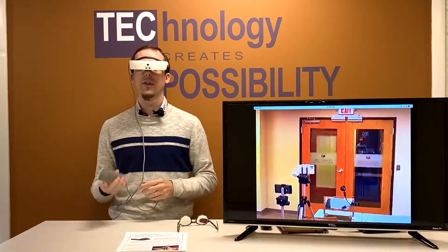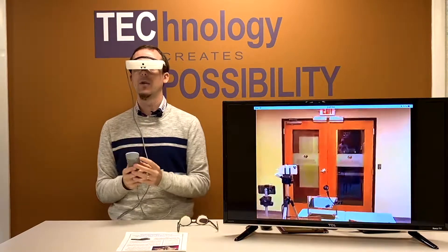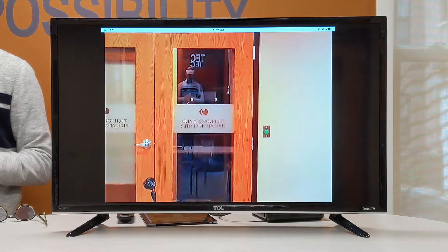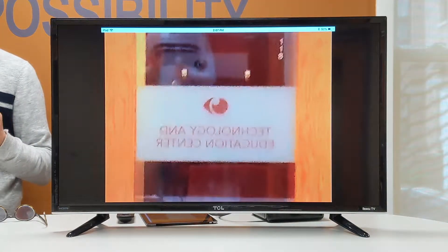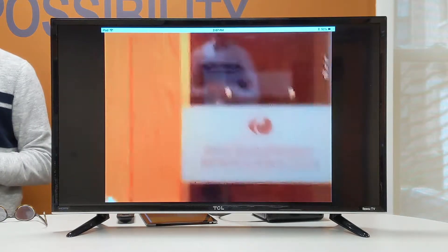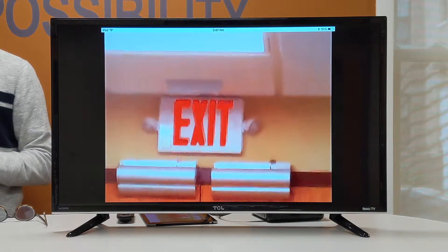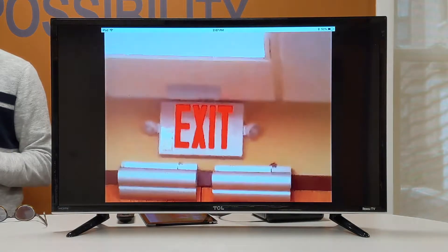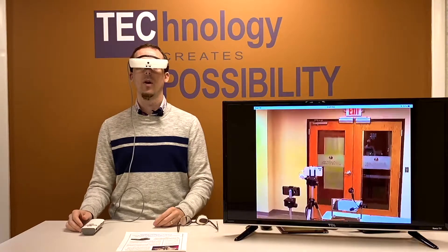Let's take a look at the magnification. This is done with a dial on the left side of the controller. I'm going to roll that dial upward — eSight is telling me the magnification level. I can turn off the voice if I want to. I'm at four times magnification. Let's look at the exit sign at the top here. Excellent, that looks good. Let's zoom in a little bit more. And now we'll zoom out. So that was very good.